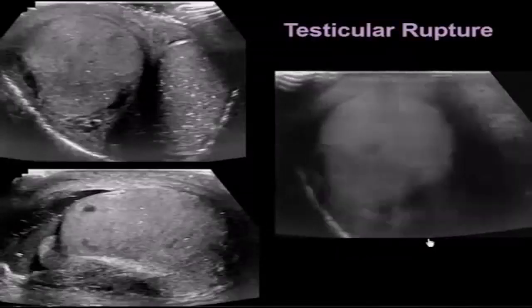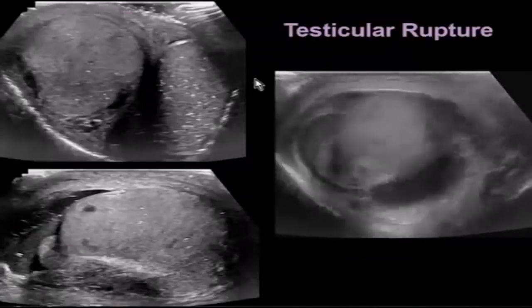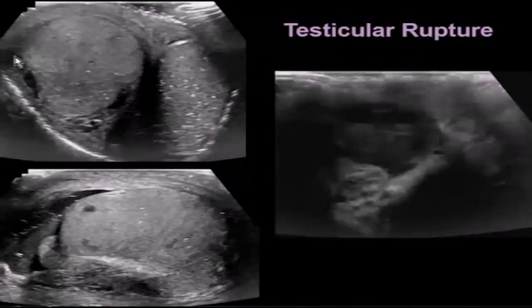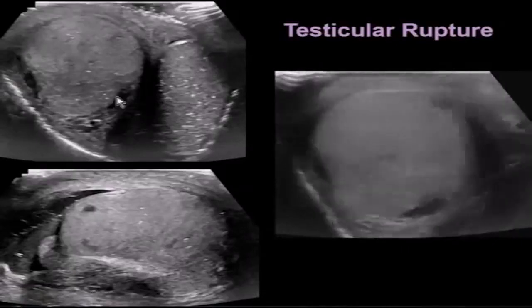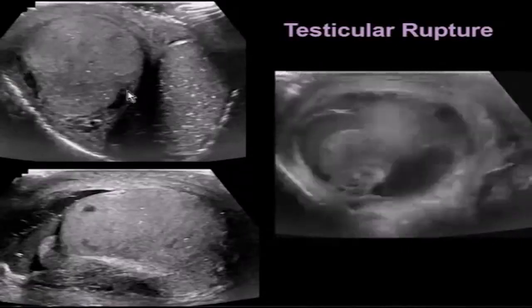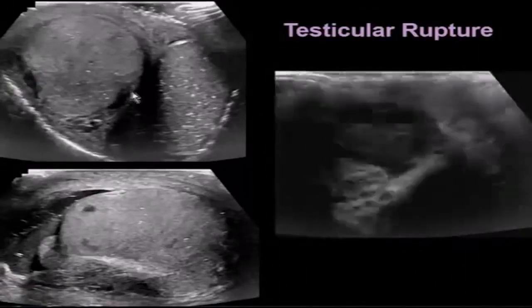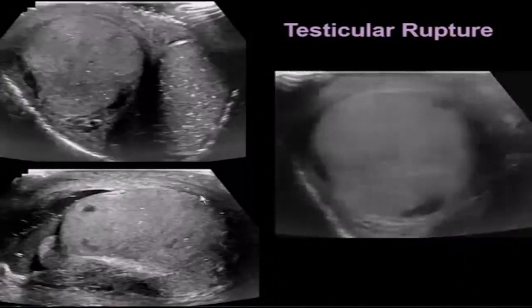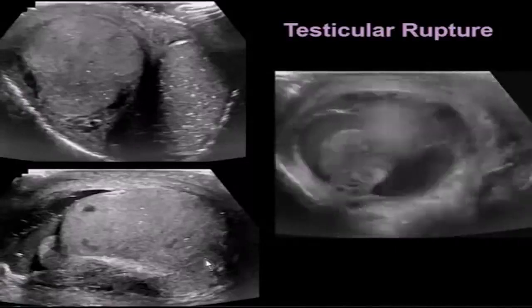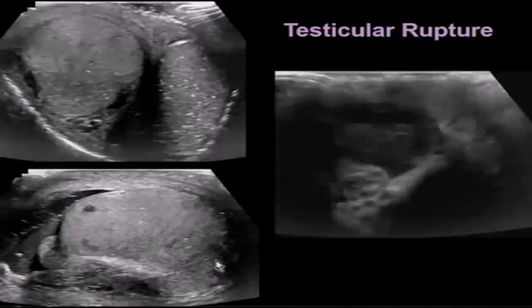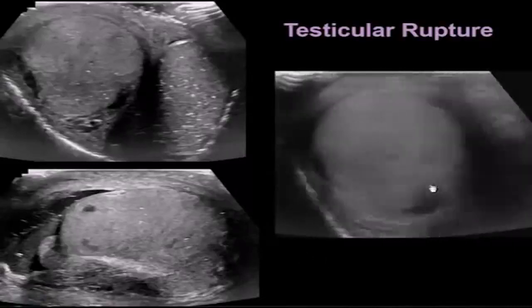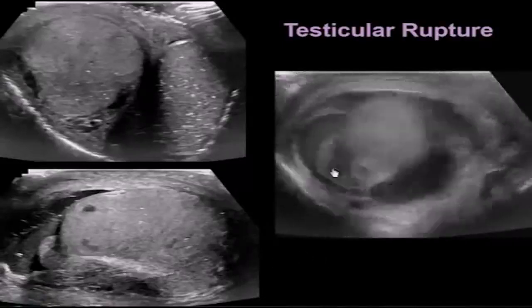Here's a patient with testicular rupture — this patient also has microlithiasis. This is the normal left testicle, and the right testicle shows a bulging and distorted posterior wall due to disruption of the capsule. On longitudinal view, we see disruption of the posterior lower pole with protrusion of testicular parenchyma through the defect in the tunica.